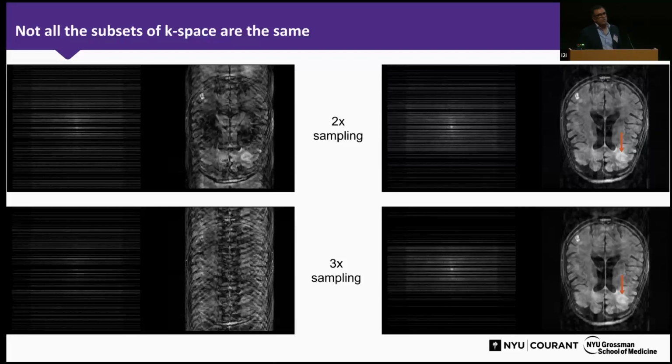Right? So this tells me something more, right? It essentially says that if I keep stretching this, there must exist some minimal number of k-space measurements that have a sufficient amount of signal to infer whether a specific pathology exists or not, regardless of what the image actually might look like. Right? Or what we call a disease signature: there must exist a minimal amount of measurements in k-space that has enough information to accurately infer whether there is a pathology or not.